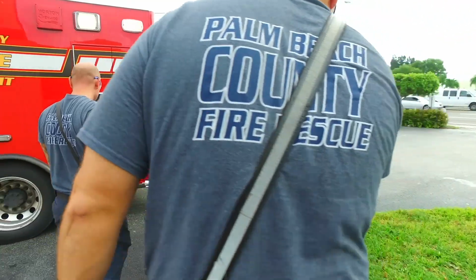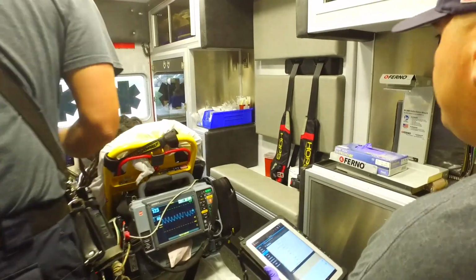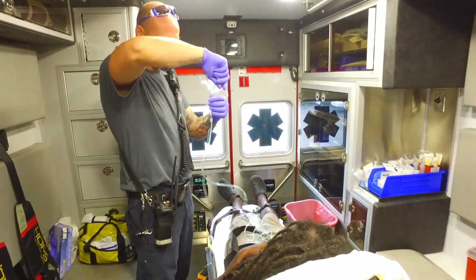And you want to also then subsequently feel, and the feel part, when it comes to this, is to be able to percuss. And I know how difficult it is for the medics in the field. It's going to be much, much, much tougher than for us when we're in a controlled environment. But even like that, I still recommend to percuss always before you do a needle decompression. And then finally, when the patient is intubated, always suspect that it's a main stem intubation.